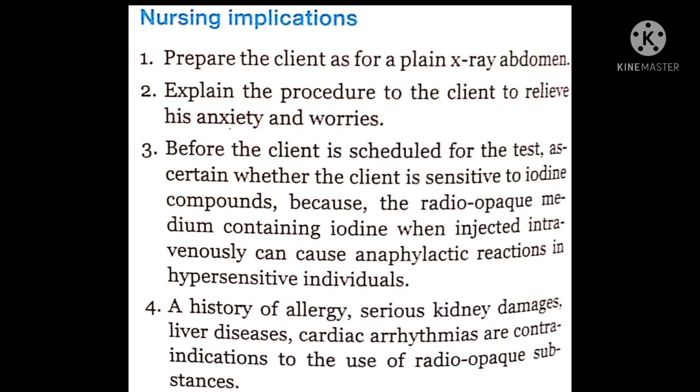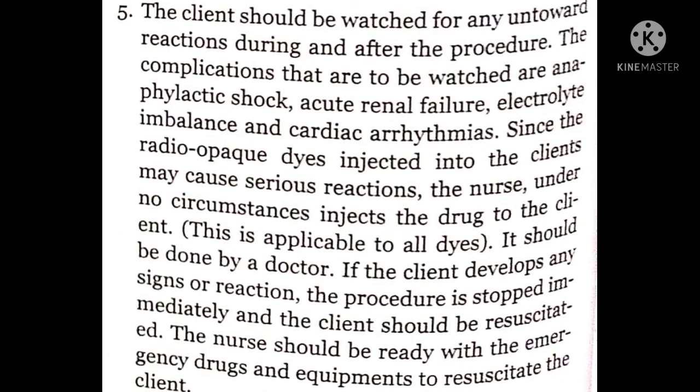4. A history of allergy. Serious kidney damage, liver diseases, and cardiac arrhythmias are contraindications to the use of radio-opaque substances. 5. The client should be watched for any untoward reactions during and after the procedure. The complications to be watched are anaphylactic shock, acute renal failure, electrolyte imbalance, and cardiac arrhythmias.